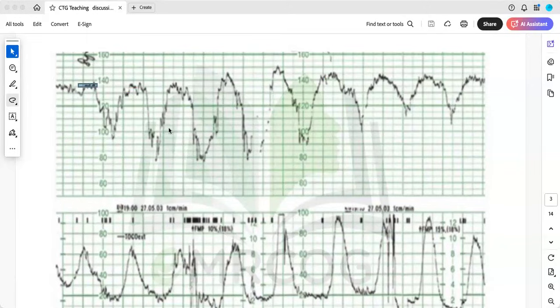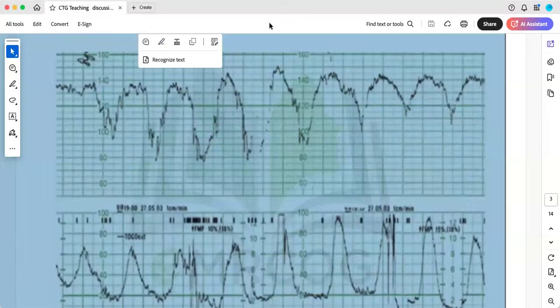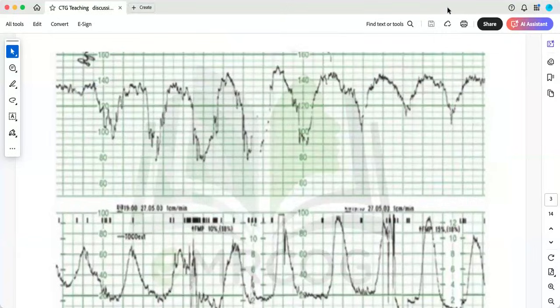What else do I have here? I have in the assessment of the fetus, variability. And for variability to be normal, I would say that beat to beat variability is between 5 to 25, the maximum. Okay, so usually we find it between 5 to 10, but we will consider it in our CTG features as 5 to 25. Very important.